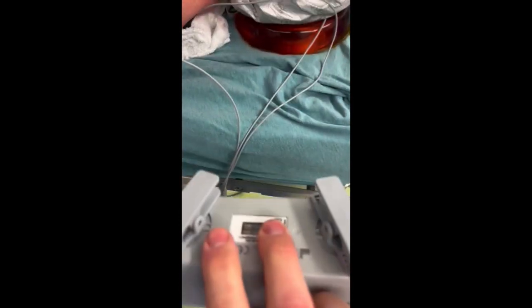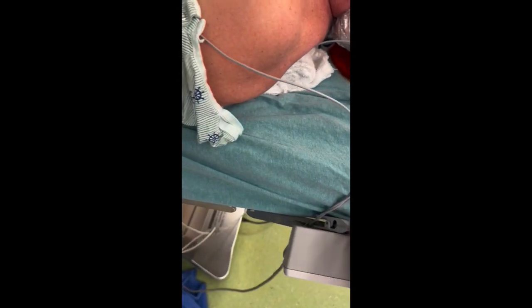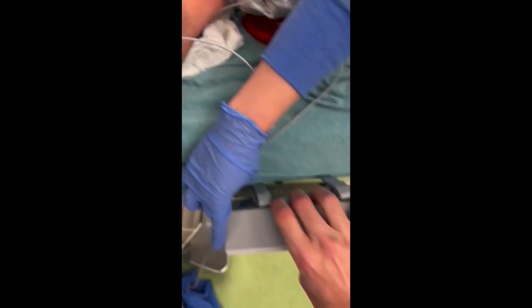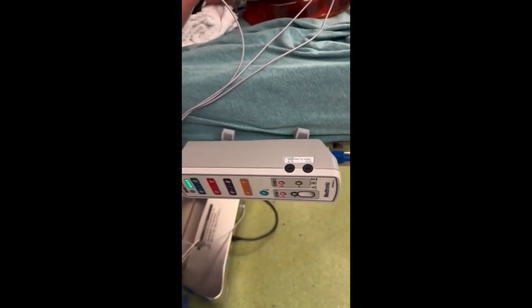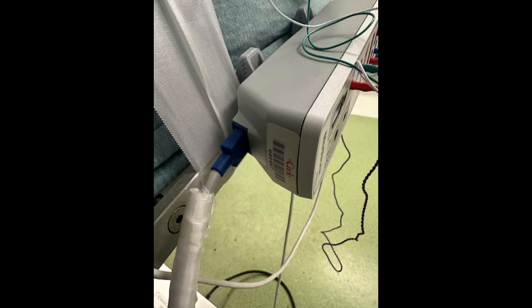The patient interface is attached to the operating room table with swiveled clips that can be spun 180 degrees, so don't let the orientation of some pictures being 180 degrees from the others in this video throw you off. Generally the interface cable remains plugged in at all times, but in case it's not, it plugs from the patient interface to the console.